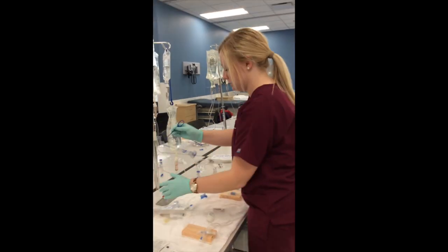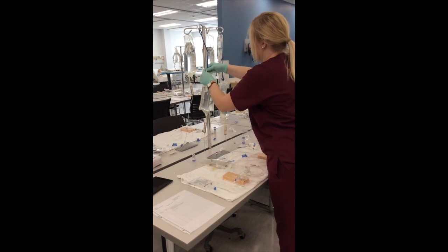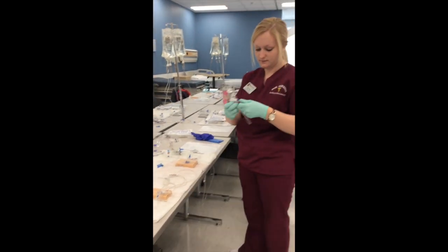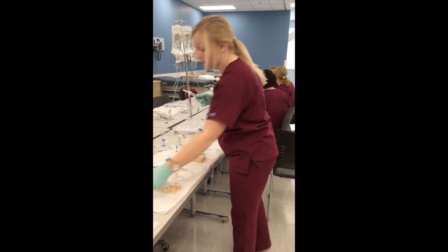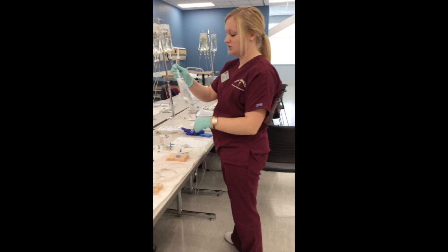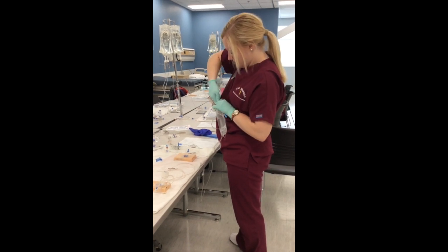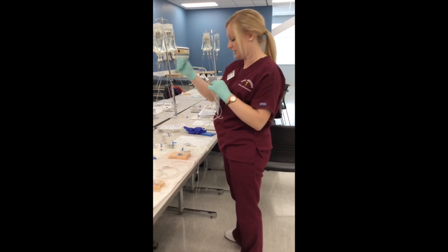So I'm going to first drop my normal saline. And then I'm going to get my secondary tubing. And as I am spiking my bag, I'm going to check for the 3rd time, make sure my patient medication rights of administration are all good. So then I'm going to go ahead and spike my bag. And I got to make sure that this is sterile, so I don't want to touch it to anything.